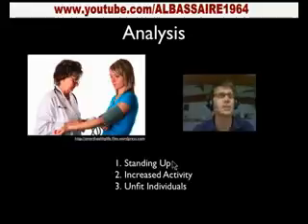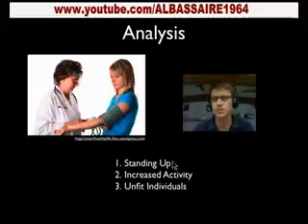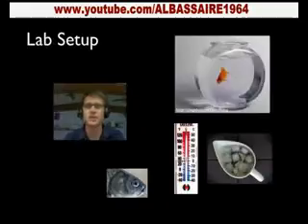And so why is blood pressure a big deal? Well, let's say you have hardening of the arteries, or a decrease in the cross-sectional area of the vessels. That's going to indicate that there's some blockage, and just like putting your finger on the front of a hose, it's going to increase that pressure. So that's the first part, using a sphygmomanometer and understanding how it works.